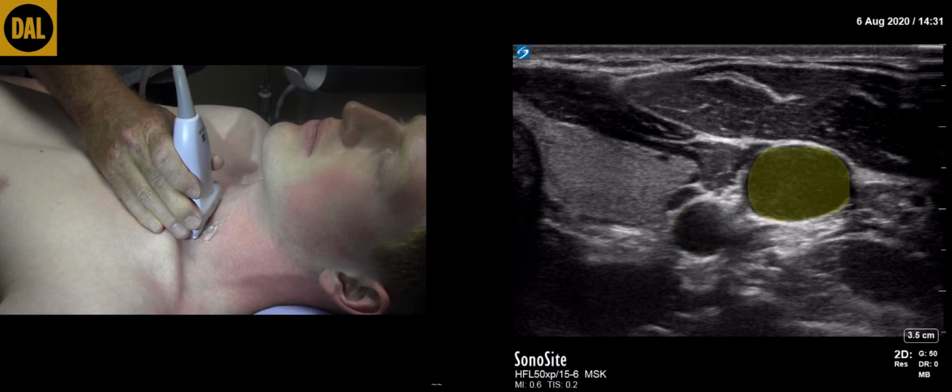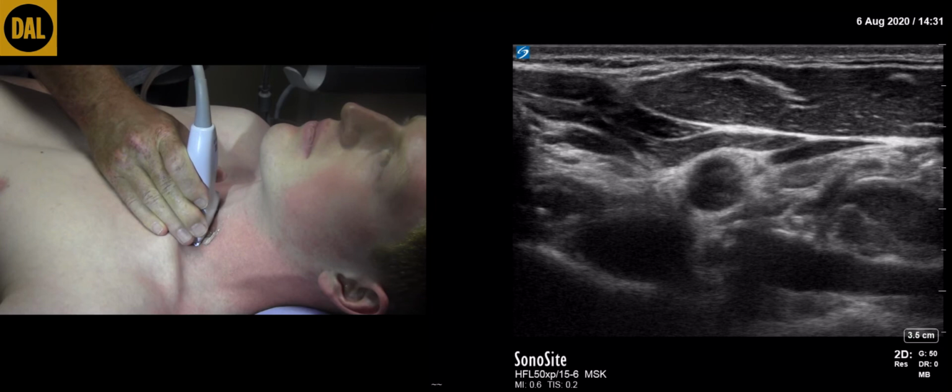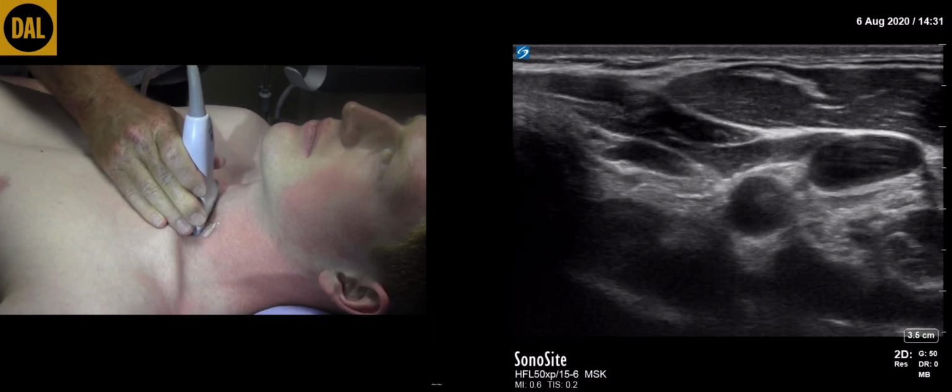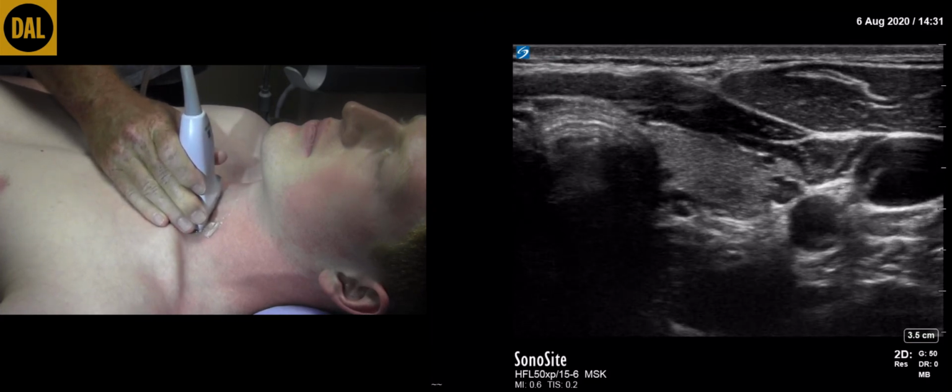The internal jugular vein lies lateral to the common carotid artery. It is larger and more oval in shape. The common carotid artery is more circular, lies medial to the internal jugular vein, and its wall appears thicker. Apply gentle downward pressure on the transducer and note how the vein is compressible, whereas the artery is not. Both vessels have a degree of pulsatility.